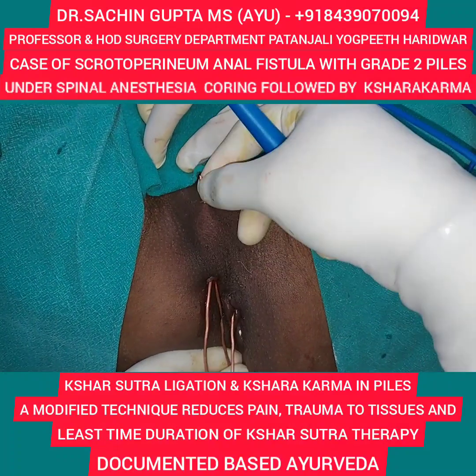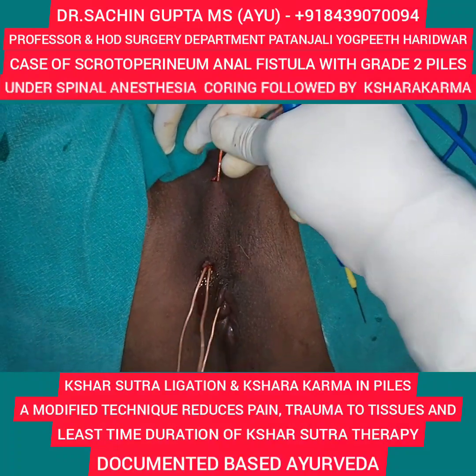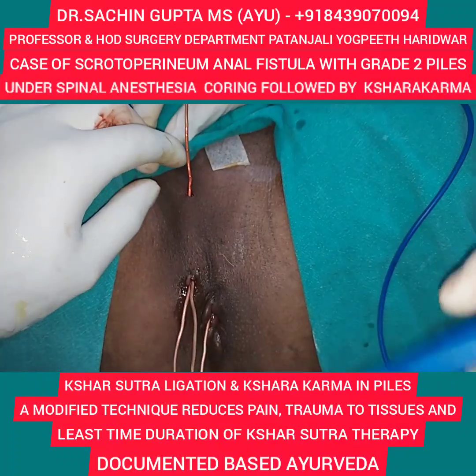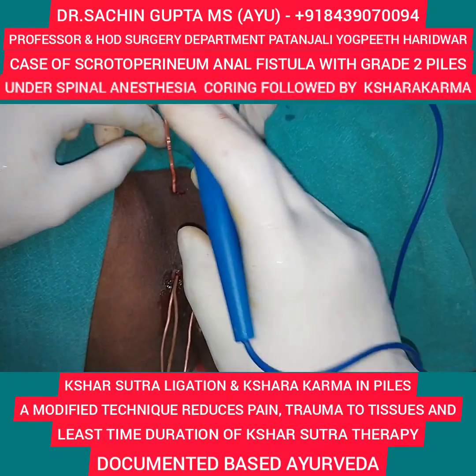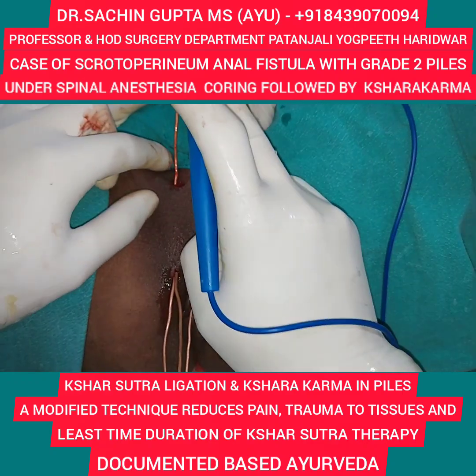Just take out the probe outside like this. Now I'll go for coring. The main careful step here is don't injure the urethra.